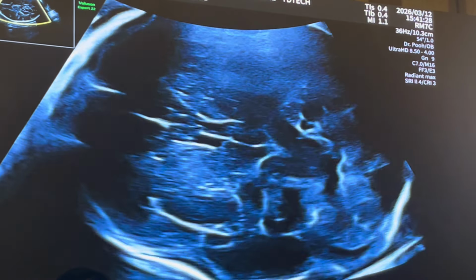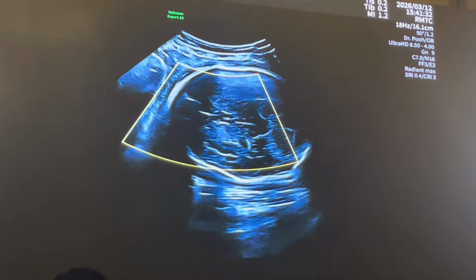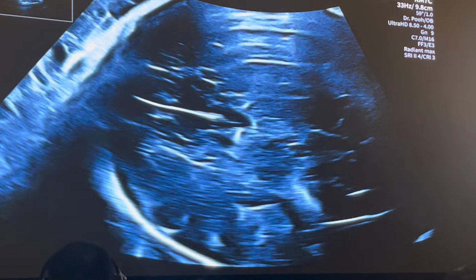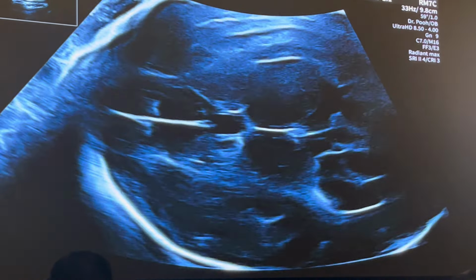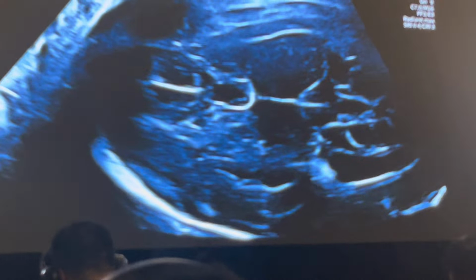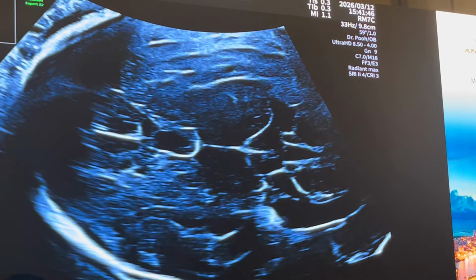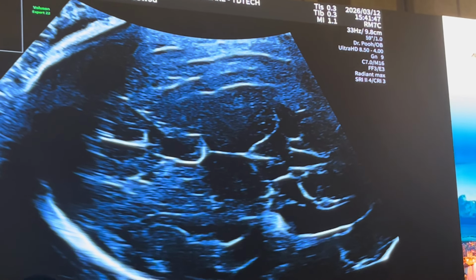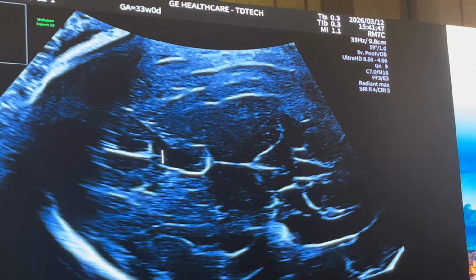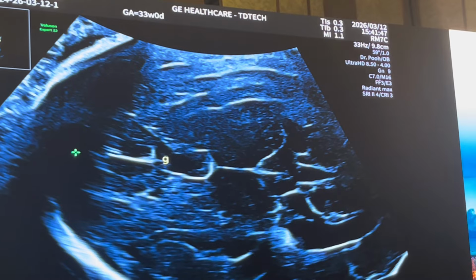I think that's an important message. Ritsuko, can you tell me, with regard to the anterior complex, are you happy with what I'm demonstrating, or would you like to see something a little bit more clearly? Do you do 3D when you evaluate the anterior complex? I always use the transvaginal sonography for looking at the exactly symmetrical structure of the anterior complex. Yeah. So therefore, it's good.